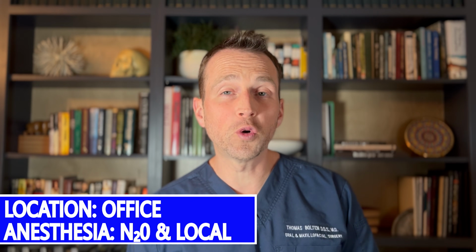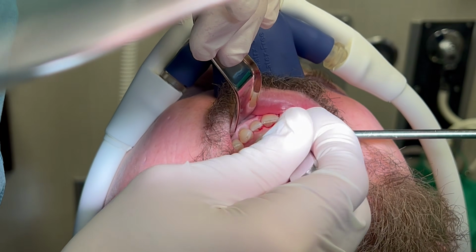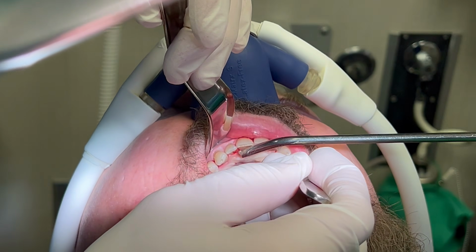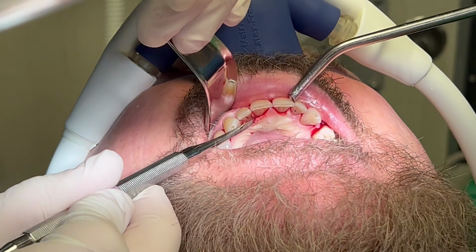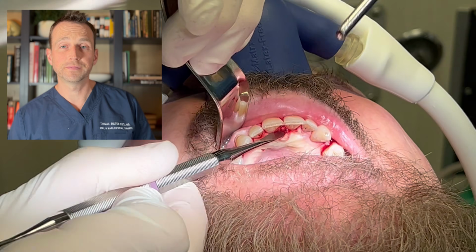This procedure is performed in the office under local anesthesia and nitrous oxide. After I obtain local anesthesia, I make an intersulcular incision along the palatal aspects of the anterior maxillary teeth. I then elevate a full thickness flap and identify the lesion.